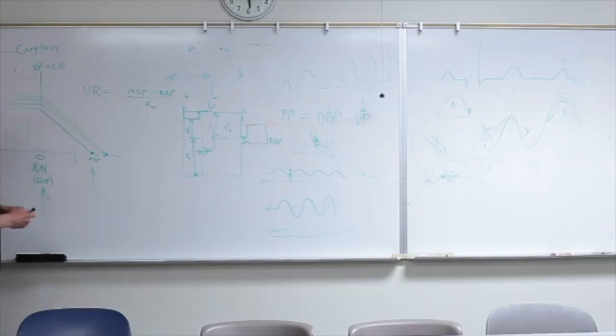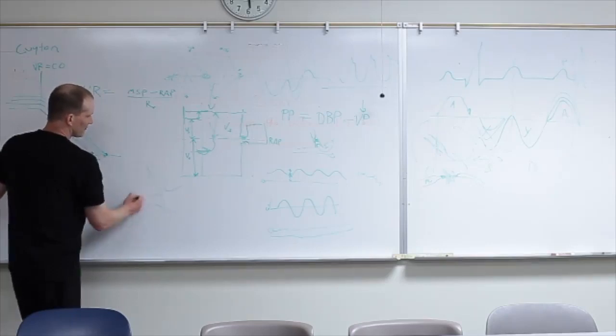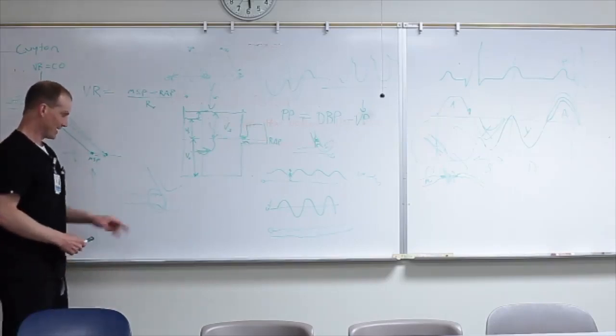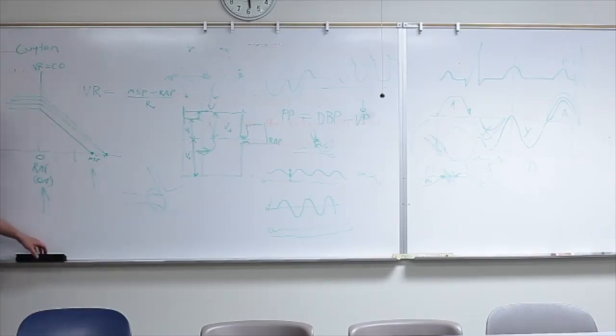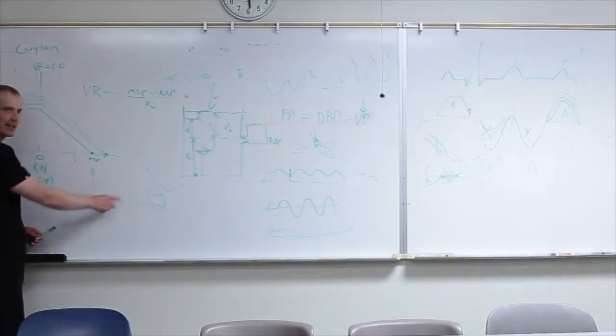We told you the specific place to look for it is what's happening around here. The reason is that's what the American Society of Echocardiography says you should measure, and that's also where all the researchers are measuring, just for the sake of consistency. But if you've seen enough IVCs, you know that what's happening here looks a lot different sometimes than what's happening here, right?